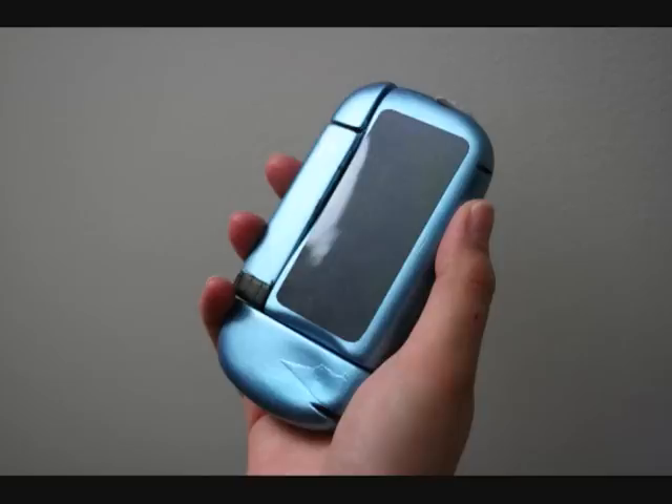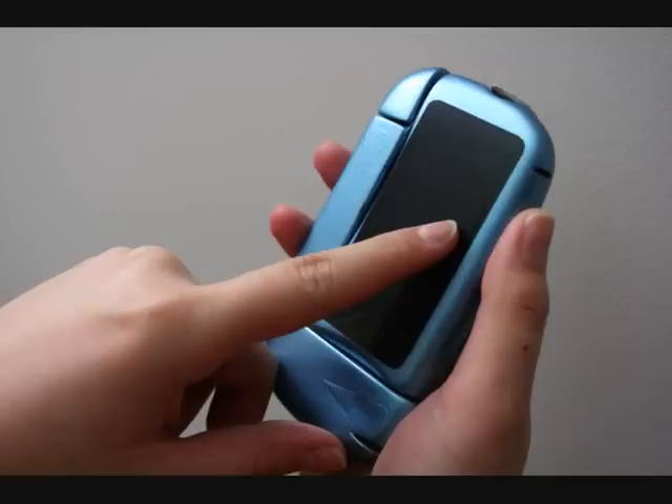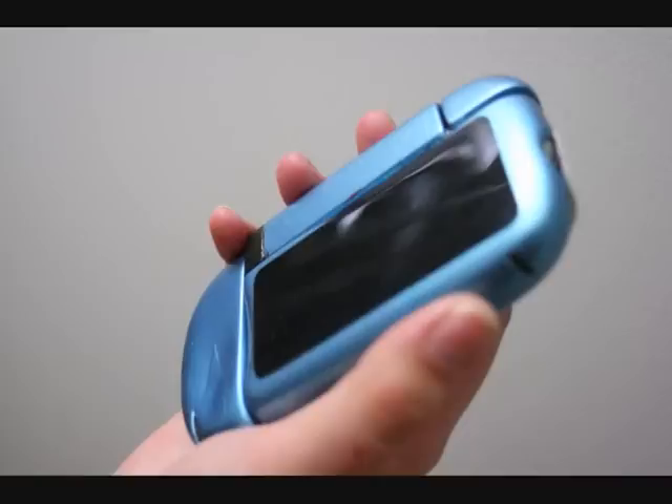The design of the Multi combines the blood glucose monitor, an insulin pen, and a portable sharps container into a compact device.